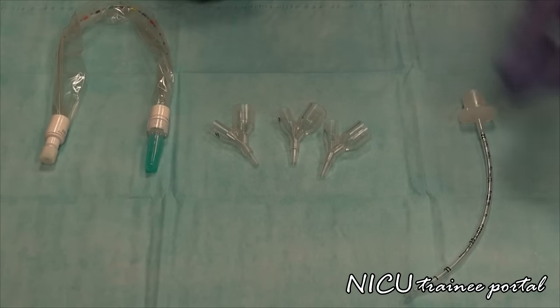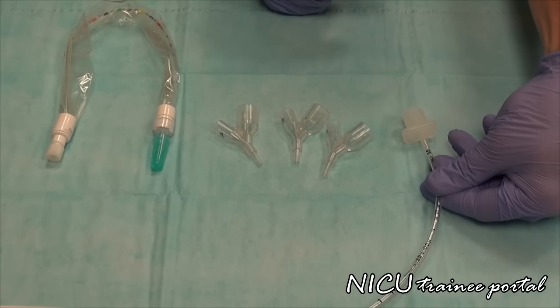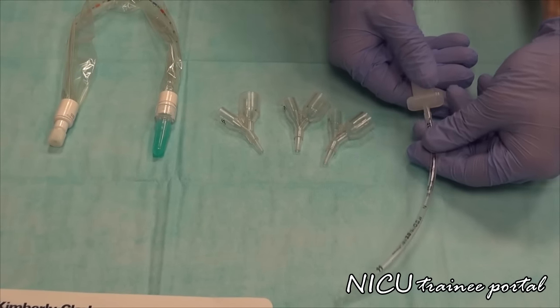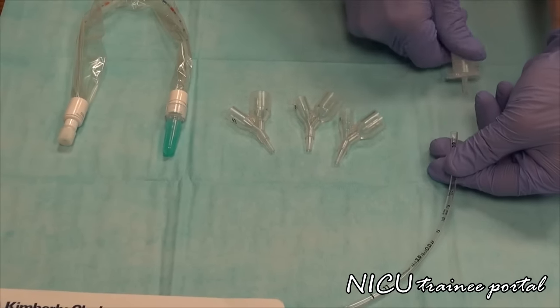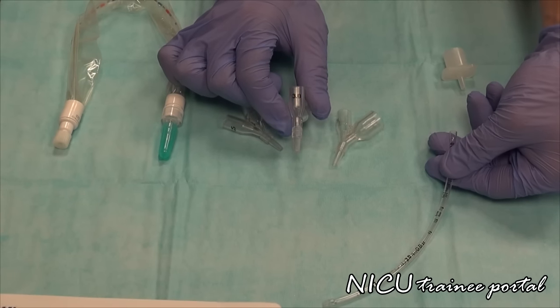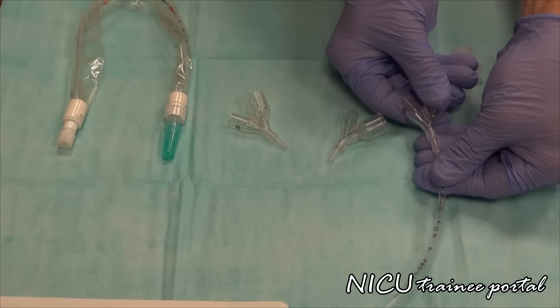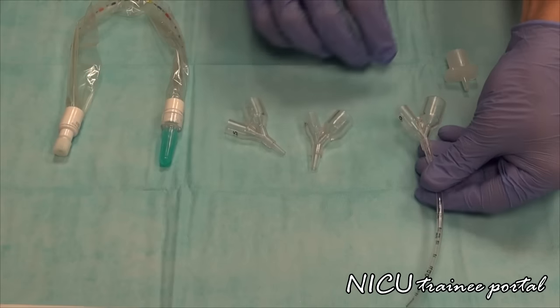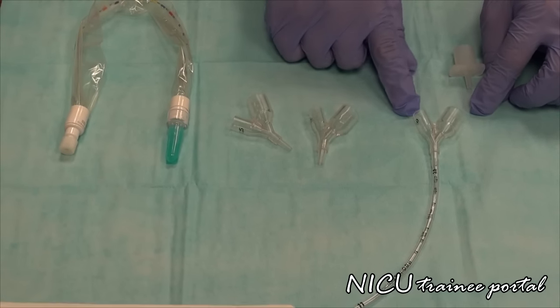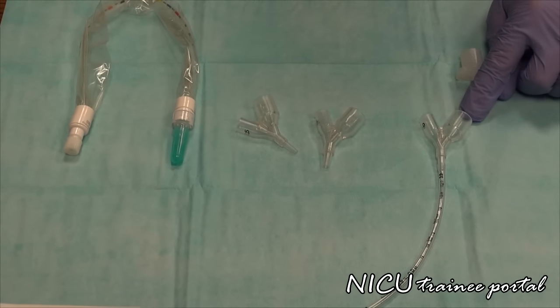For the proper setup, we have a 3.0 ET tube. What we do is remove the stock adapter from the ET tube. We then get the appropriate size surfactant adapter, which is the 3.0. We put that where the original adapter was. The setup has one port for our catheter and the other port for your manual bag or your ventilator circuit.